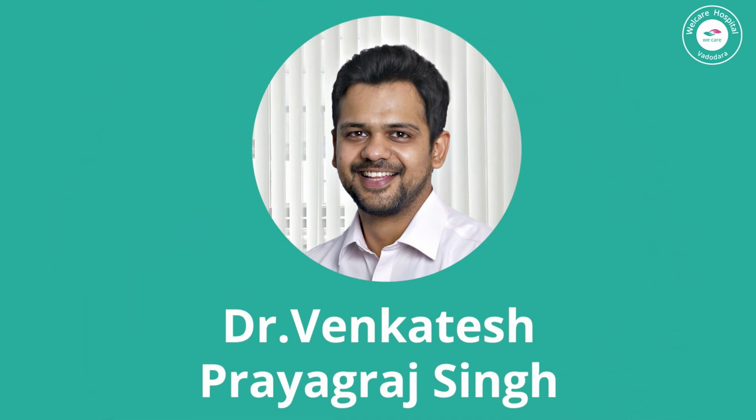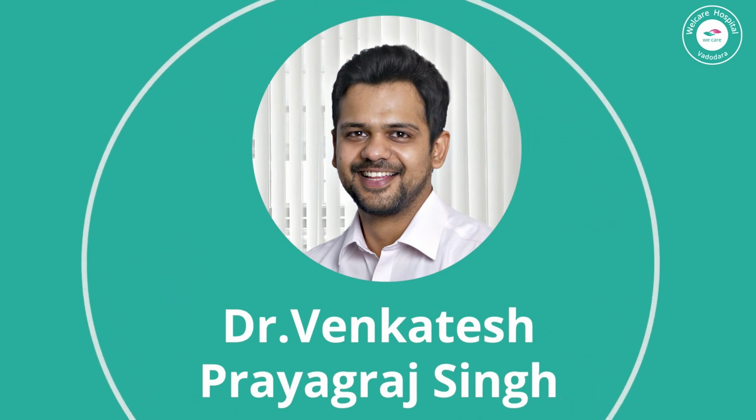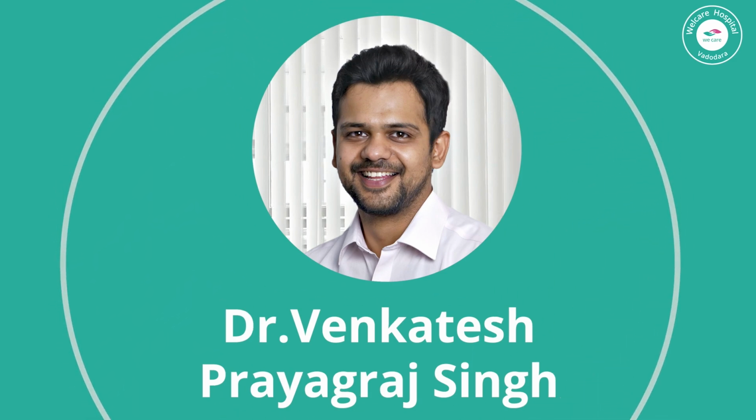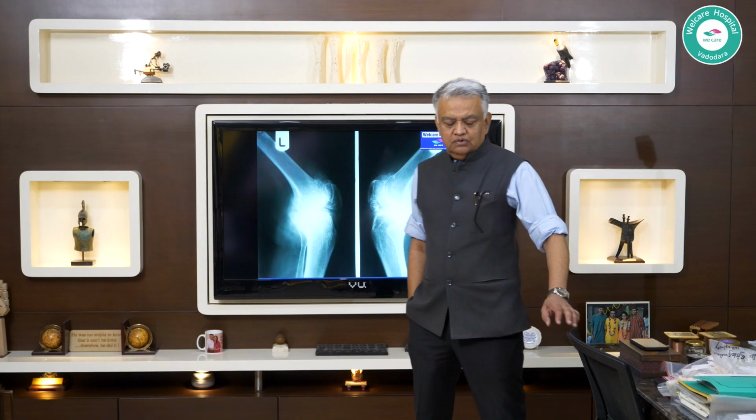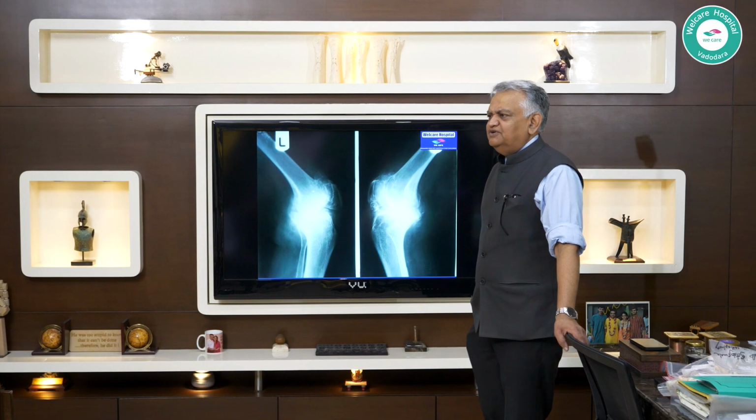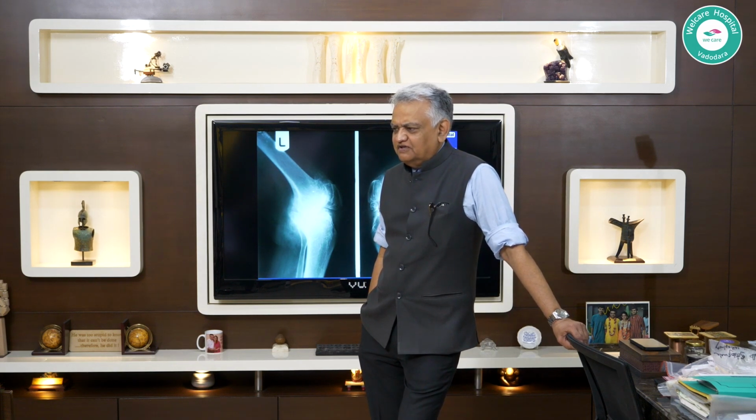And so any other implications we have to be aware of during the surgery upon the different deformity levels, apart from the jig placement, any other step we have in this particular deformity? About the varus deformity, sir, whether it is at the shaft level or the... No. So I mean, only if you take a scanogram will you know for sure what the femoral bowing is in the coronal plane and all that.